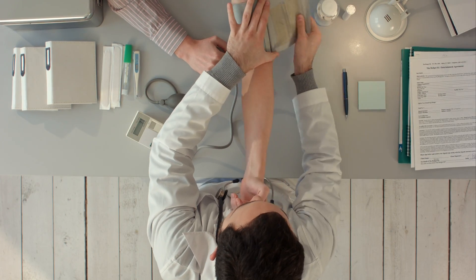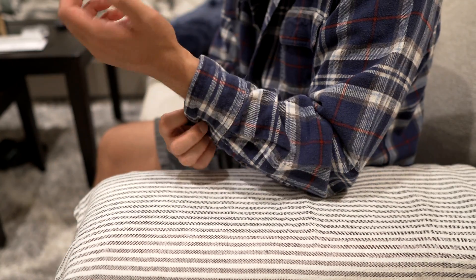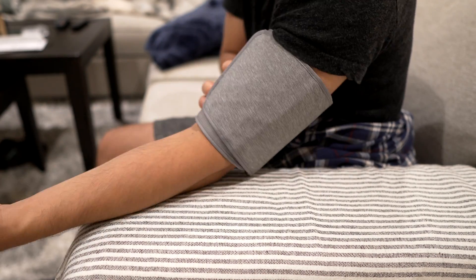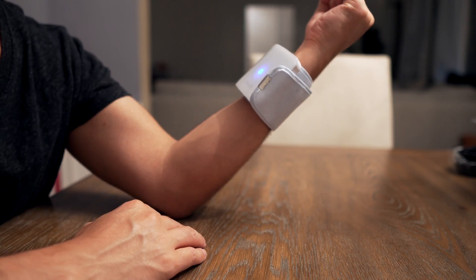It's probably the reason why most hospital blood pressure cuffs are still upper arm and not wrist straps. But if you ask me or any other doctor, the biggest problem when it comes to blood pressure monitoring is compliance. We're all human and we still slack off and get lazy because it's inconvenient — you've got to roll up your sleeve, take off your jacket, and get that strap on. Whereas with a wrist cuff, you don't have to do any of that because it's small and easy to put on. So if having a wrist cuff can motivate you to check your own blood pressure at home more consistently, then I think that's great. Actually checking your blood pressure is better than doing nothing at all.